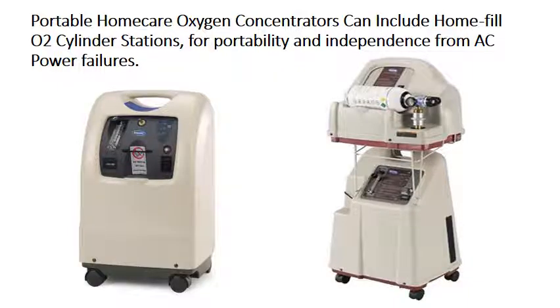So an oxygen concentrator is often not used when oxygen is critical to the survival of the patient because loss of power can cause the loss of the oxygen source. And we know that can be a chronic problem in Tanzania. However, there are also stations which allow the oxygen concentrator to pressurize and fill an O2 tank. This can even be done at home for home use, and the tank is certainly a much more reliable source of oxygen, at least until it's exhausted.